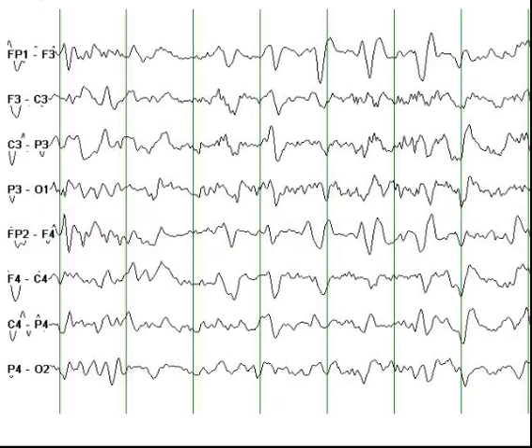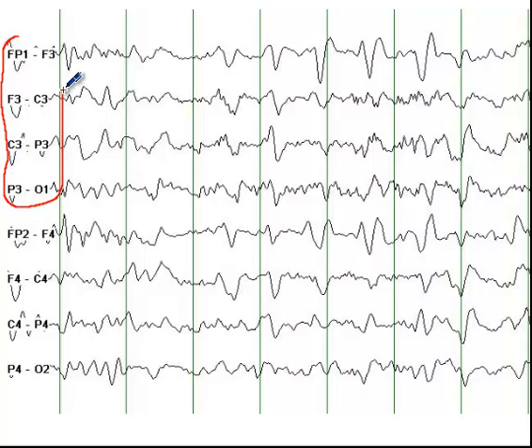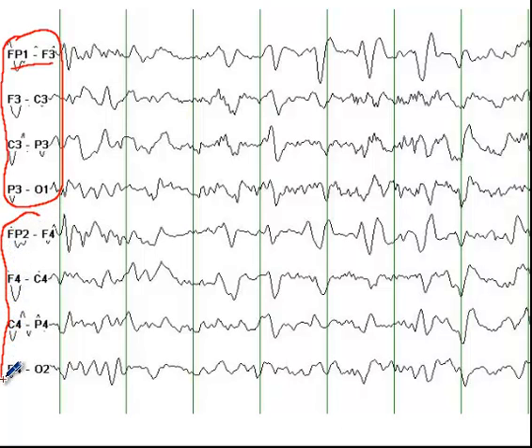So this is an EEG, just for the sake of orientation — you have the left hemisphere recording here, as we discussed in EEG101. Labels which end with an odd number, so F3, P3, O1 — these are odd numbers, so this is recording from the left hemisphere. And these are all even numbers recording from the right hemisphere.